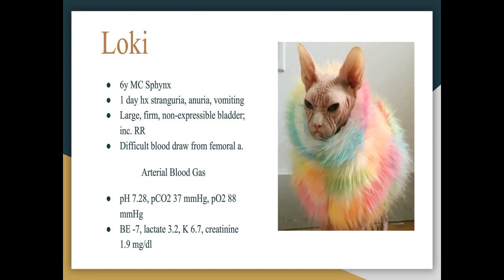If you do not know whether the increased respiratory rate is due to pain, anxiety, or an altered respiratory status, you obtain an arterial blood gas. Unfortunately, Loki is not the most pleasant patient, and you have a difficult blood draw from his femoral artery.